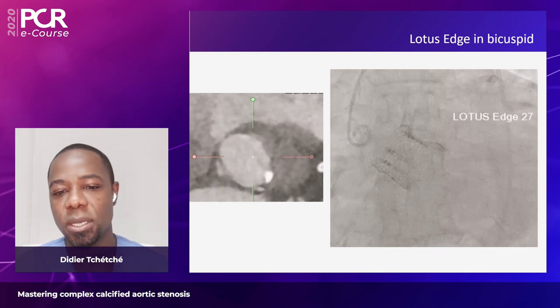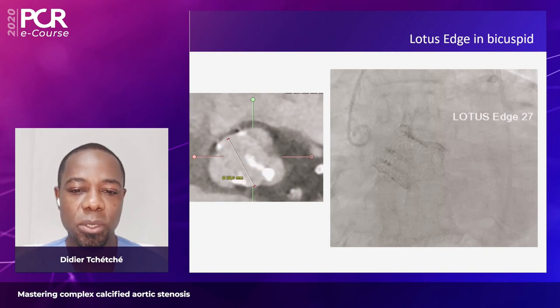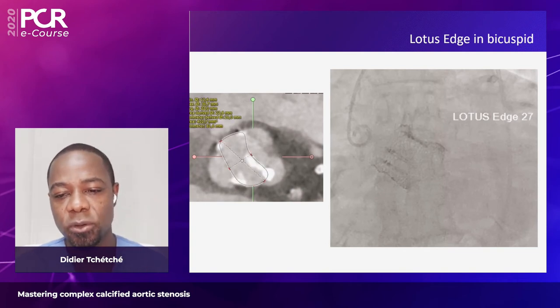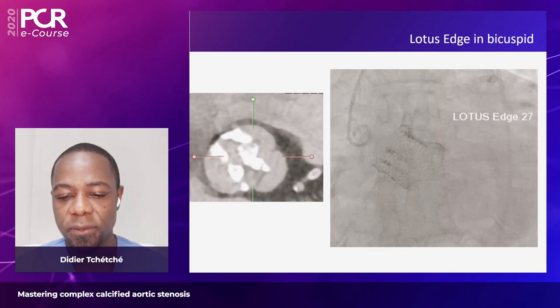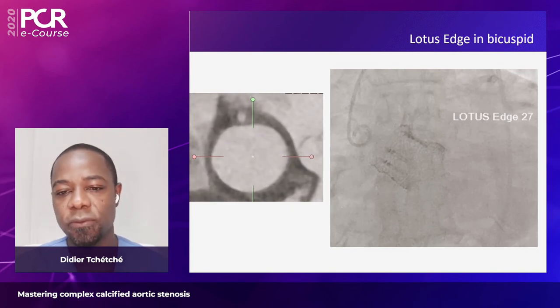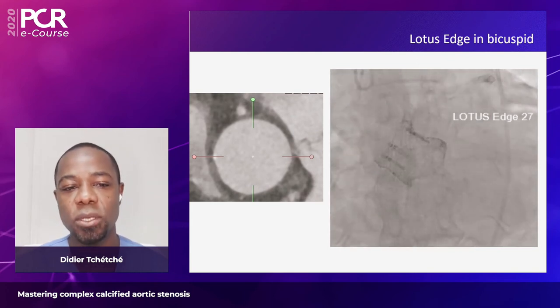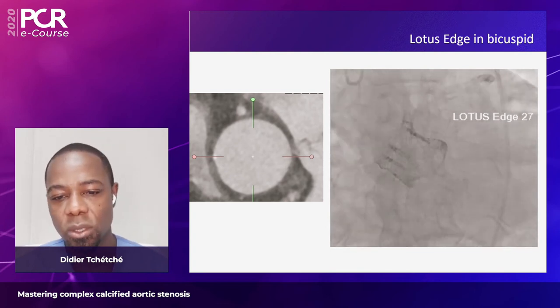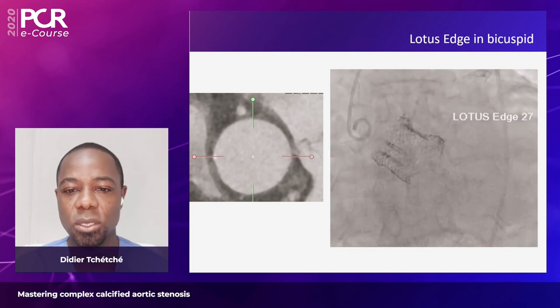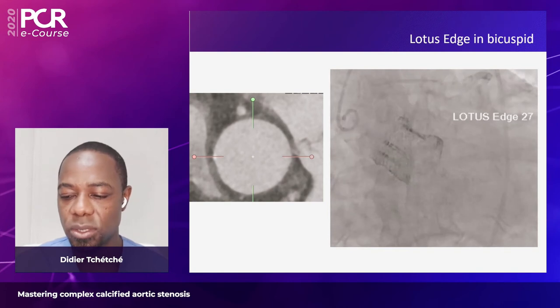But this is just an example of a patient with a difficult sizing, because you know that sizing is quite challenging in bicuspid patients, with the annulus providing sizing for one subvalve size, the supraannular tracing for another one. And with that device that is able to more or less conform to the anatomy of the landing zone with an adequate reshaping, avoiding being too aggressive, we may end up with a good location of the device, one device utilized, no need for post-dilatation, no regurgitation. And these are features that are, in my opinion, extremely interesting also.